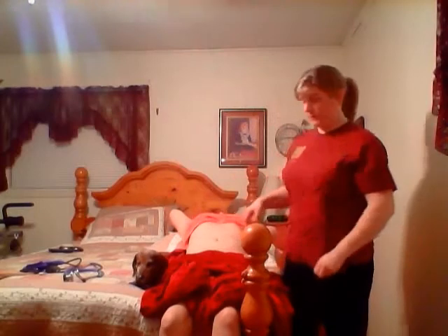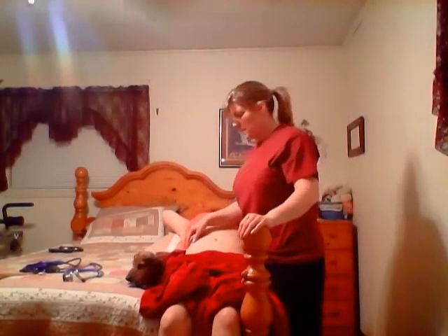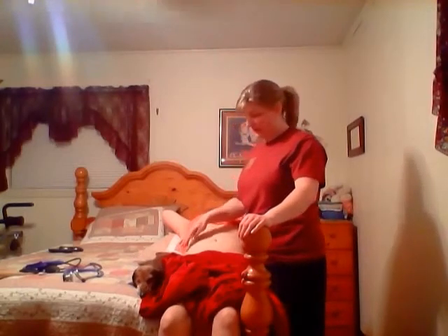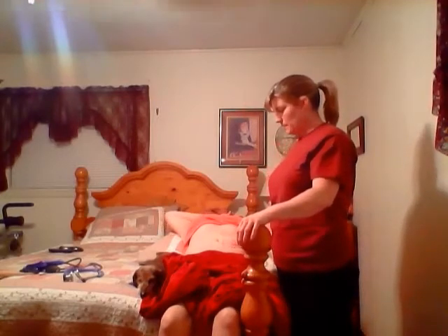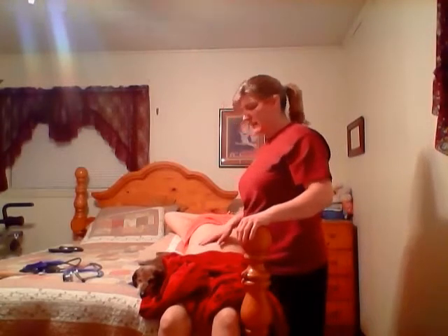Ashley does wear an insulin pump, so we can see the insulin pump site is intact. On a patient like this, you'd want to look for any signs of infection, any areas where it appears that they use that pump site too much. Of course, encourage them to use site rotation, so that they wouldn't get any of that edema, and so that they don't become resistant to the insulin in that area, and to keep the skin nice and soft.